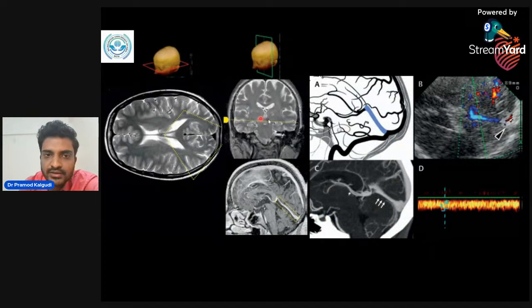This is a difficult one. Neither an axial plane nor a coronal plane visualizes this. So what I do, I start off with an MCA in an axial plane and I turn it into coronal, but I won't turn it completely. It's a semi-coronal plane. All that you need to do is imagine that you're looking at the straight sinus and then tilt your probe appropriately. This is the tentorium. Generally when you see the tentorium cerebelli, that's where you have your straight sinus descending downwards.